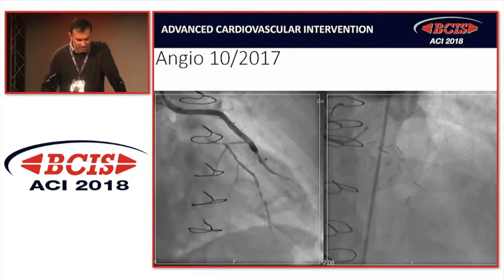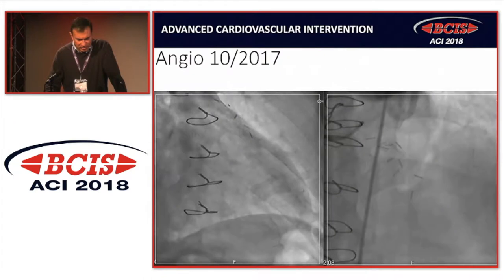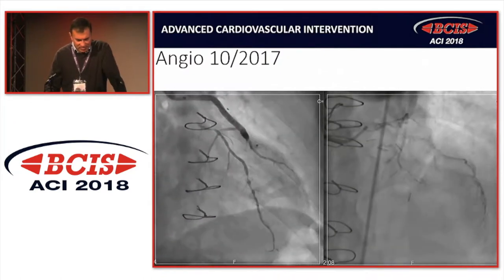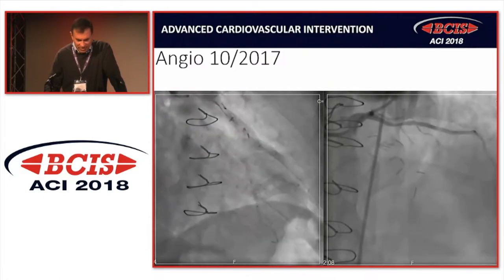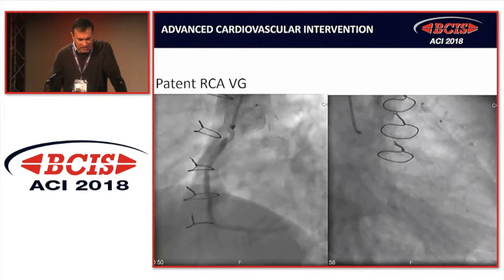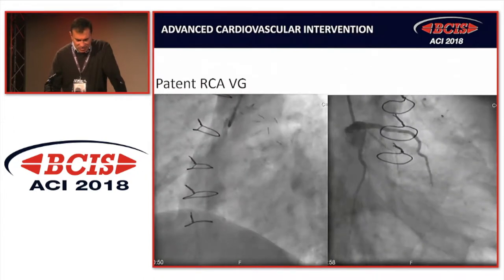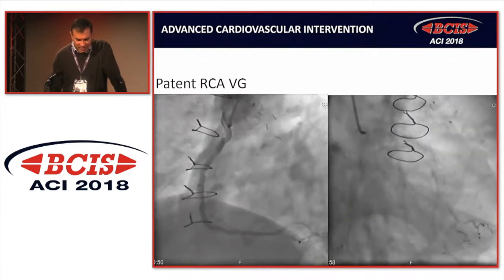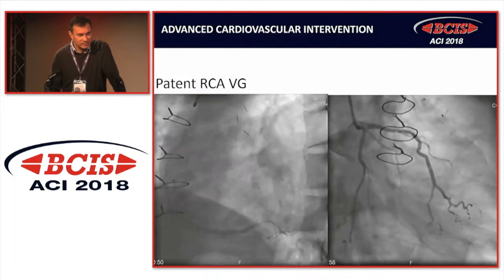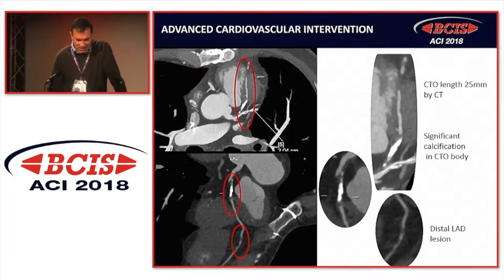His angiogram shows the vein graft to the diagonal. The LAD is occluded and the vein graft is backfilling to the LAD. There's significant disease in the mid- to distal LAD as well. The vein graft to the right is open. The LAD is flush occluded at the origin of a diagonal. He's had a CT, and the CTO length is 25 millimetres by CT, and there's a significant amount of calcification.